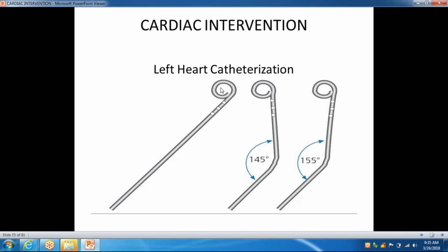It can puncture the myocardium, and I have seen complications where I'm not sure if they used a straight catheter, but I've seen complications where the left ventricle muscle was perforated, and when they did the LV gram, you could see the dye going into the pericardium, and that was a mess.